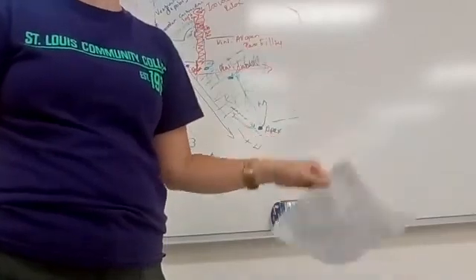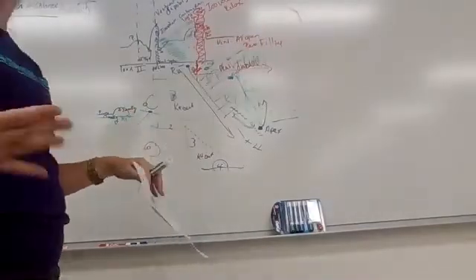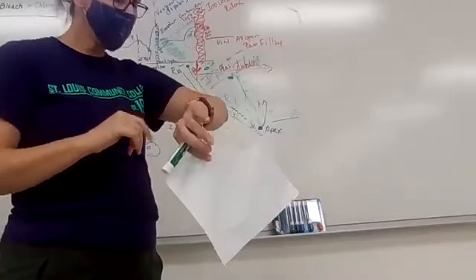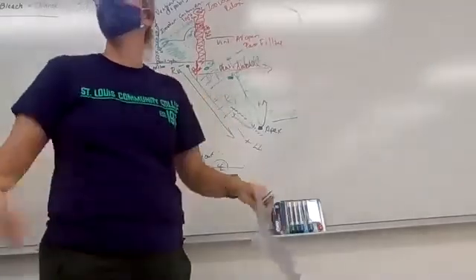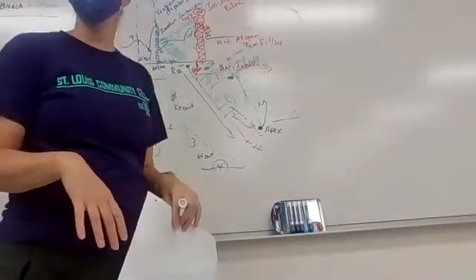Yeah, especially if they're a little nervous, right? Or they're tapping their feet or kind of fidgeting a lot, right? Because what am I at right now? I'm at 98 right now. Okay, and I'm not doing a lot of work, but, you know, fidgeting a little bit.